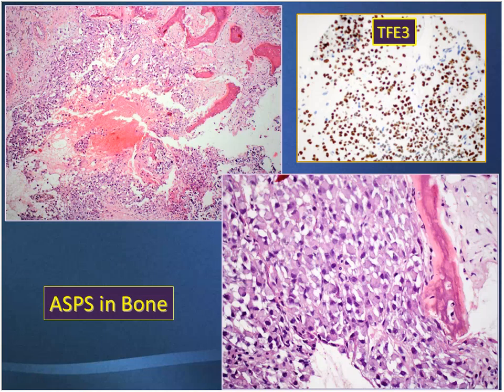First, we thought it was an epithelioid malignant tumor, which was shown to be not so, but a sarcoma. TFE3 positivity proved that this is an alveolar soft part sarcoma, although it is a very difficult differential diagnosis.